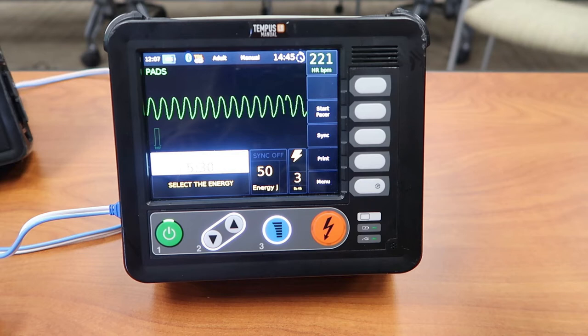So in this scenario, you're a paramedic. Let's say our patient's a 68-year-old man presenting with chest pain, hypotension at 78 over 42, and he just had a syncopal episode, so he is currently unconscious. All this to say the patient is symptomatic and he is unstable. So as the paramedic, you have decided it is time to cardiovert.